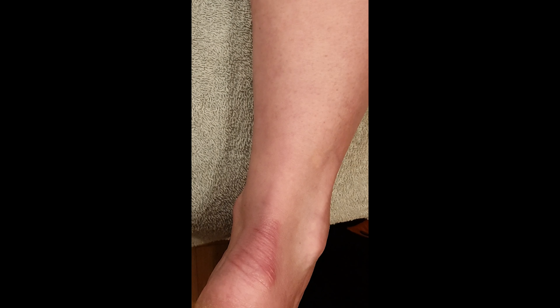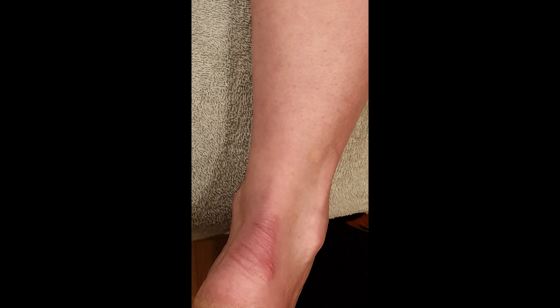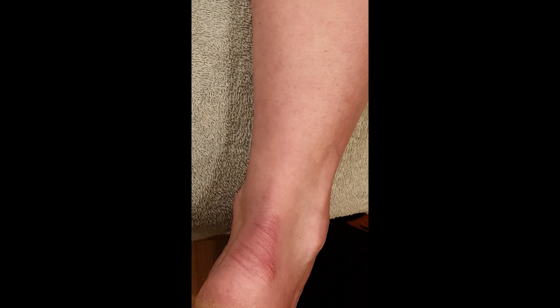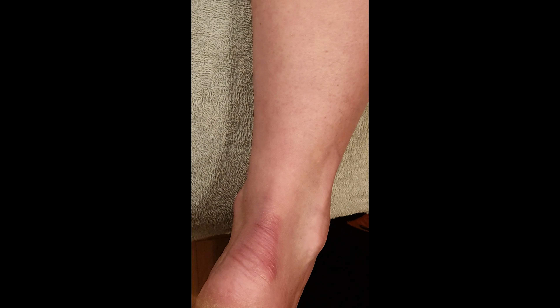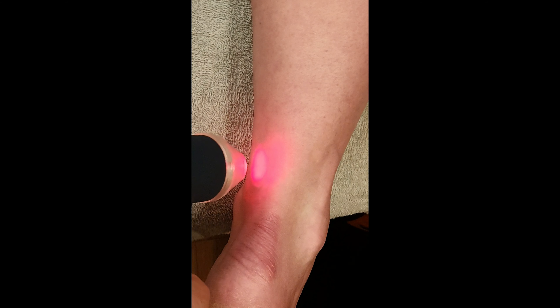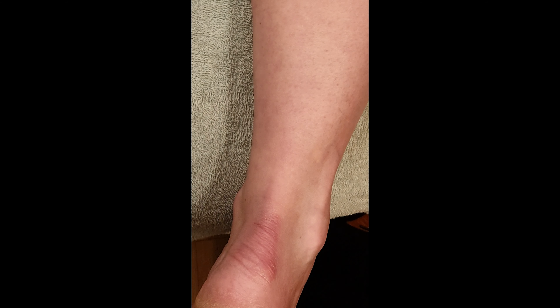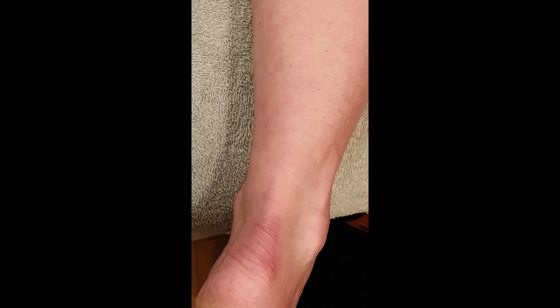From the patient's perspective, we're going to be doing three spots on the Achilles tendon. You really want to aim for the thickest part, or if there's no swelling, the most painful part, and then up and down from that — spot one, spot two, spot three. If you were doing the bursa underneath the tendon, you'd come from the side so you don't lose too much energy into the Achilles tendon before hitting the bursa. In this case we'll come spot one, two, three, and the treatment will be split up across the two minutes. Let's begin in the middle.